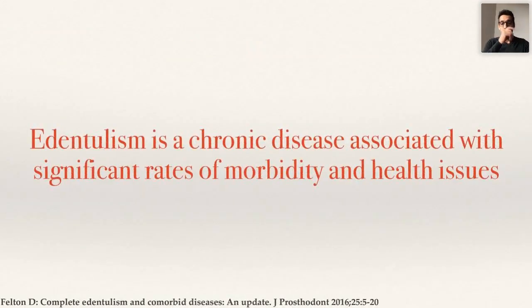Okay, so before I go into the nitty-gritty of pterygoid implants, what I'd like to do is just set the scene and talk about edentulism and how big a problem it is around the world. Also note, although today the focus of the webinar will be on pterygoid implants in relation to full arch implant treatment, pterygoid implants can be used for short spans to avoid sinus lifts, and I'll go into that later. But specifically today, I'll be focusing more on full arch.